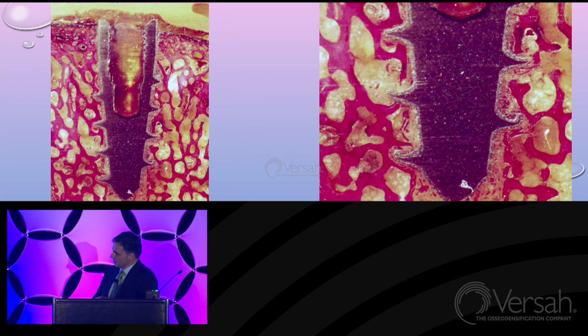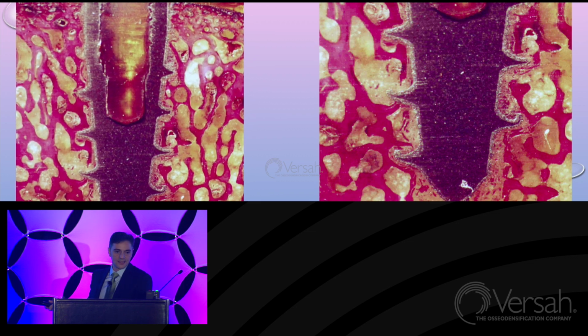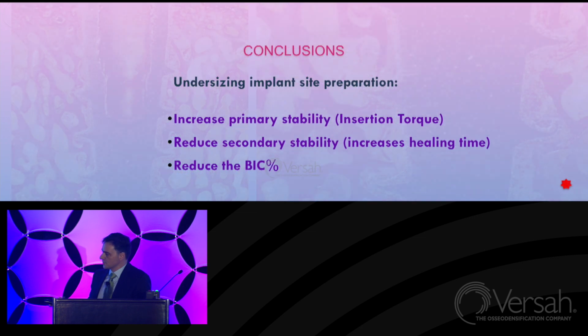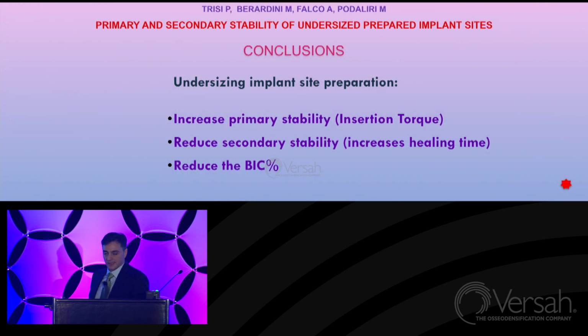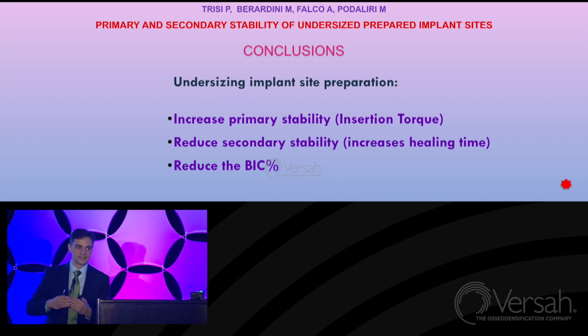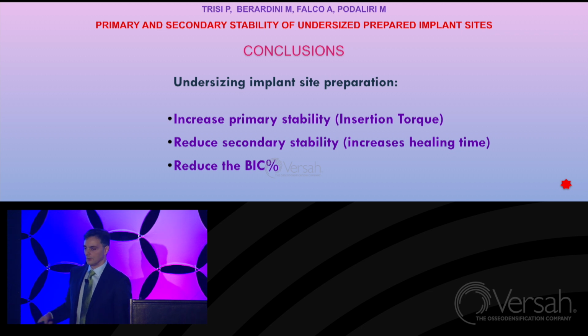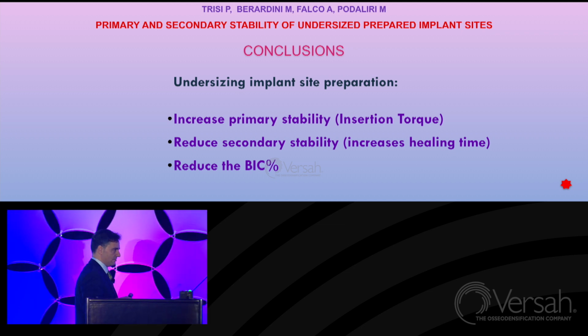So the conclusion from this study is that undersizing implant site preparation can increase the primary stability. We measure the insertion torque, which is an indicator. Of course, it can reduce the secondary stability. This means that it will increase the healing time and also reduce the BIC at the same time.